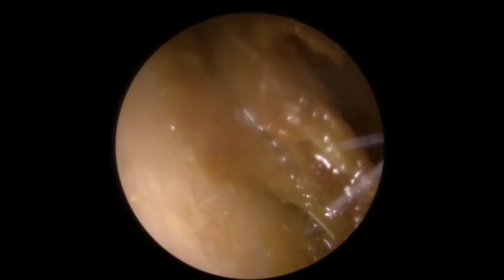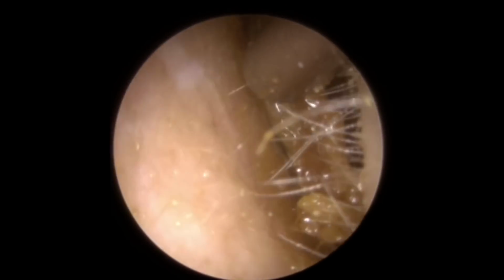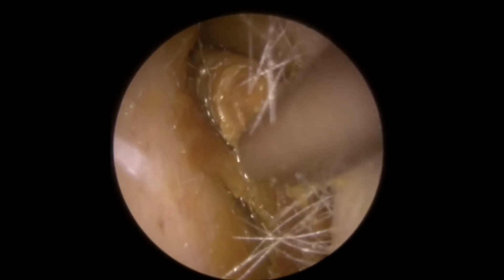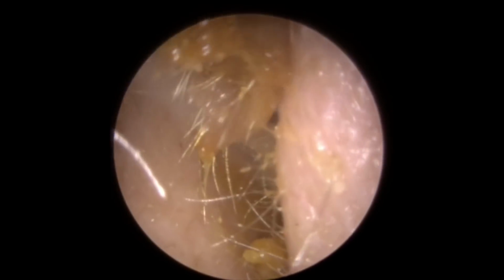Now what we can see at the entrance here is a pocket of skin. Where the canal wall skin has come out, it hasn't detached from the canal wall, so it's formed this pocket, almost like a little sleeve of skin on the outer part of the ear canal. So that's what we're going to need to remove first. You can see where the skin's actually concertinaed up here at the top. As you pull it, it stretches out. So this is excess skin production at the entrance to the canal.